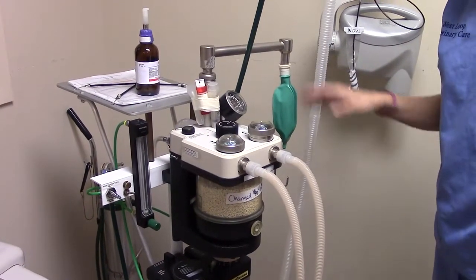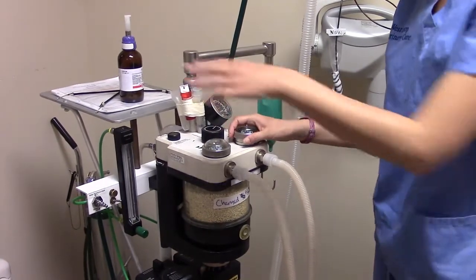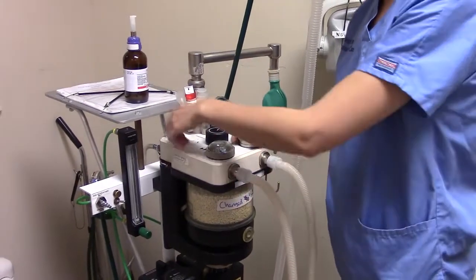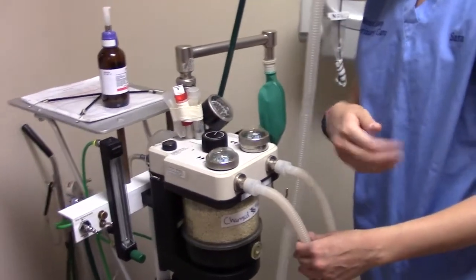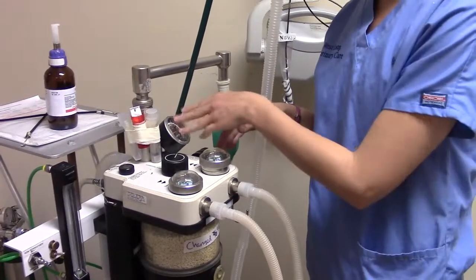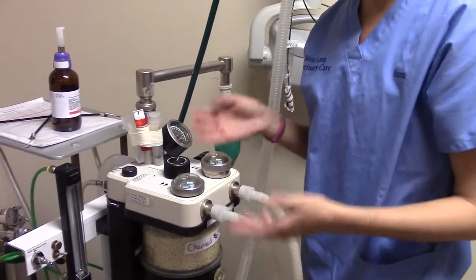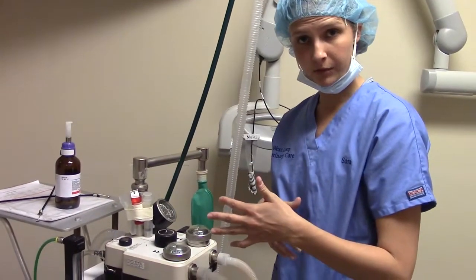Up here are the one-way valves. The inhalation valve only allows gas to go this direction, while the exhalation one-way valve only allows gas to go this way. This ensures gas flows in the right direction so our patient isn't constantly re-breathing the same gases.